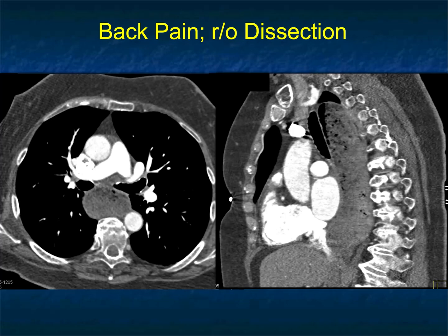What do you think? Well, you look at the aorta and the aorta looks okay, at least what we see of it. There's no pericardial effusion. But what about the esophagus? Look how dilated the esophagus is — there's also food in there and fluid. You have to think maybe there's obstruction, maybe there's a tumor, though I don't see one at the esophagus or GE junction. Maybe the patient has reflux, but this is essentially too much material for reflux — it's markedly dilated. Everything else looks good in this patient.